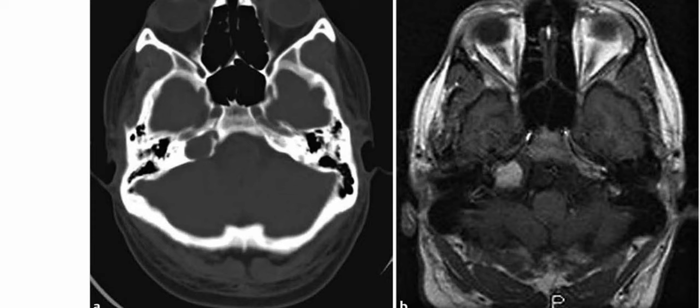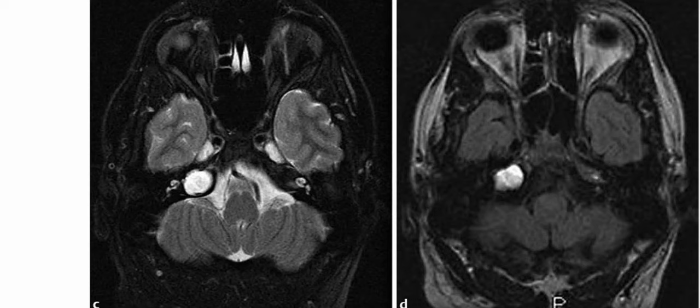These are images of a 37-year-old man presenting with headaches and vision loss. On the axial CT scan in bone windows, there is an expansile lucent lesion within the right petrous apex. This lesion is hyperintense on the unenhanced T1-weighted MRI and also hyperintense on the T2-weighted fat-suppressed MRI sequence.